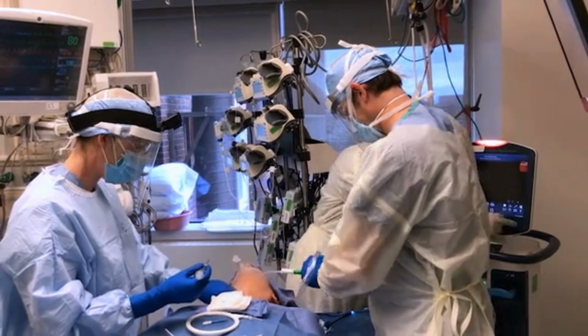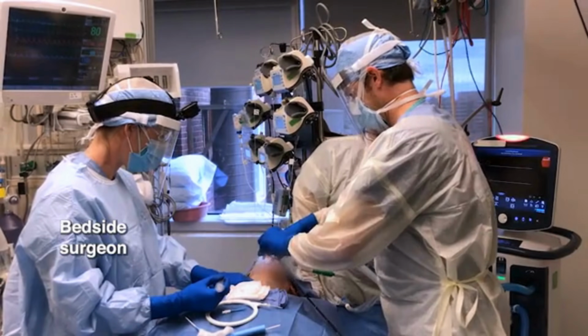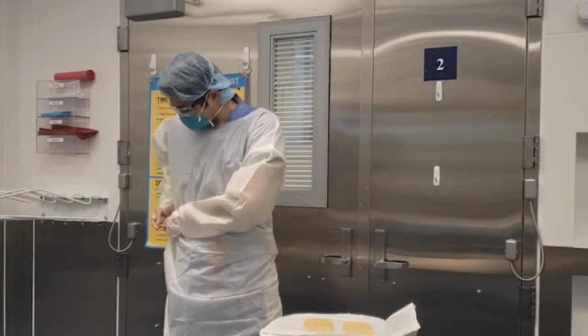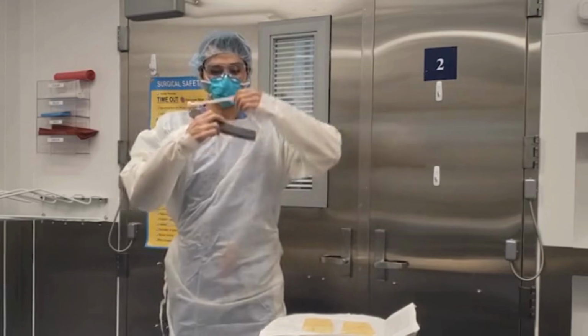For safe percutaneous tracheostomy, at least 3 people are needed: a bedside surgeon, a bronchoscopist, and a respiratory therapist. This is considered an aerosol-generating procedure. All personnel must wear PPE, following your institution's guidelines for such procedures.